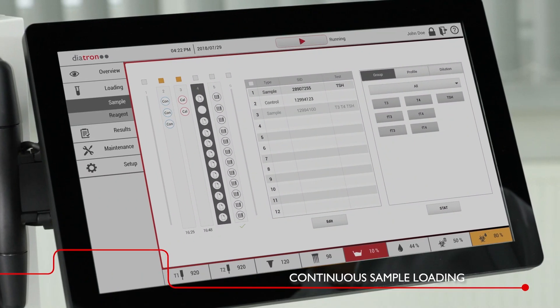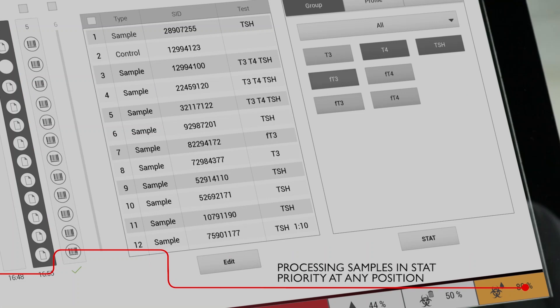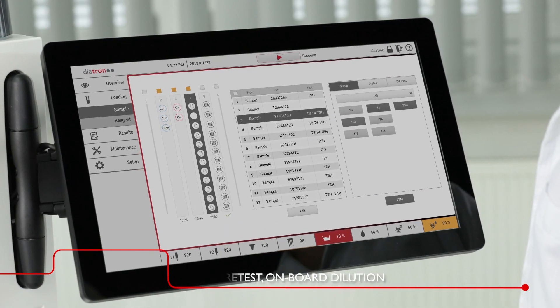The work list can be obtained from an LIS or entered manually. The system allows for stat samples to be assigned at any position and automates the management of reflex, retest and dilution testing.